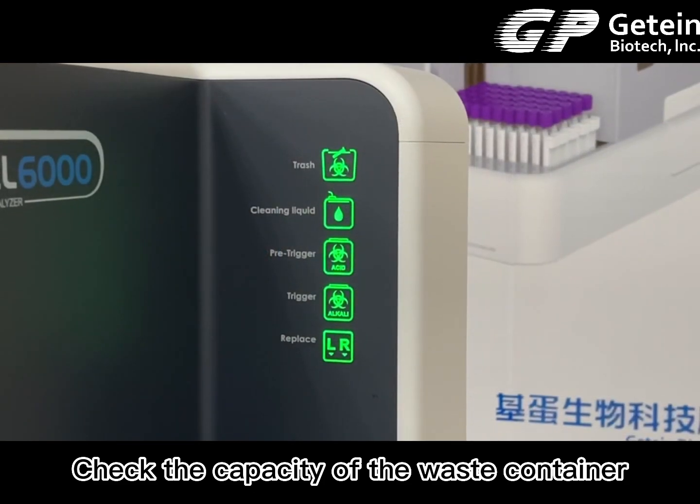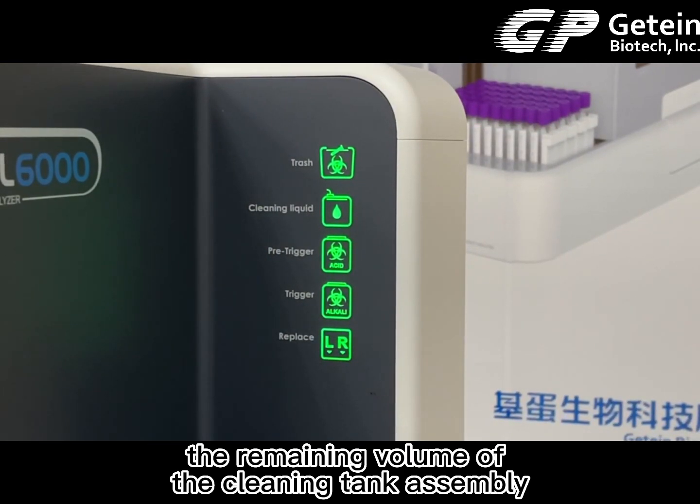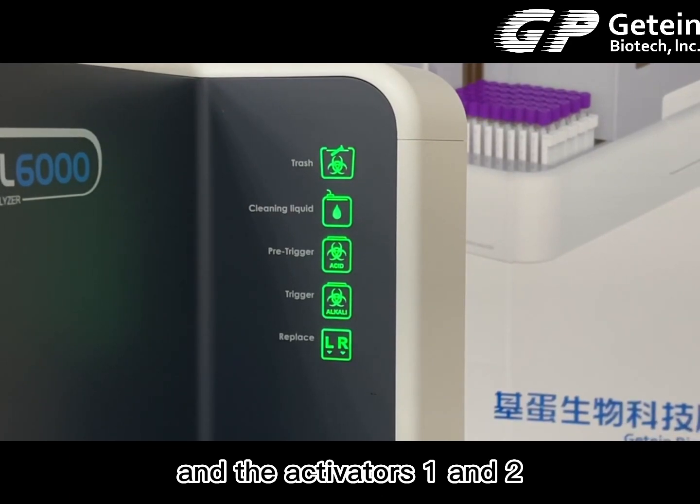Check the capacity of the waste container, the remaining volume of the cleaning tank assembly, and activators 1 and 2.